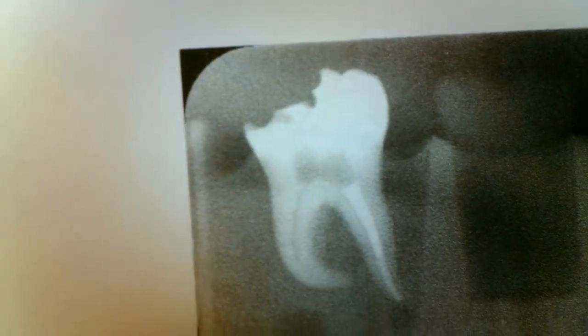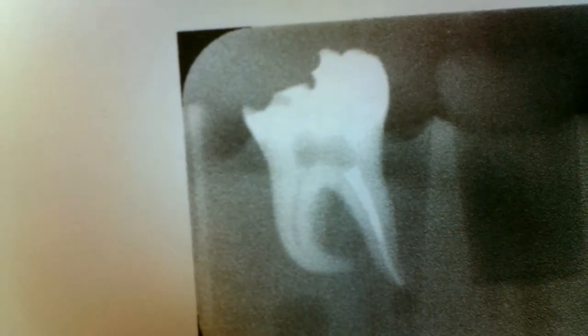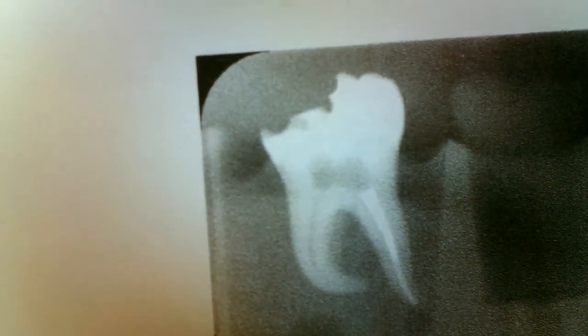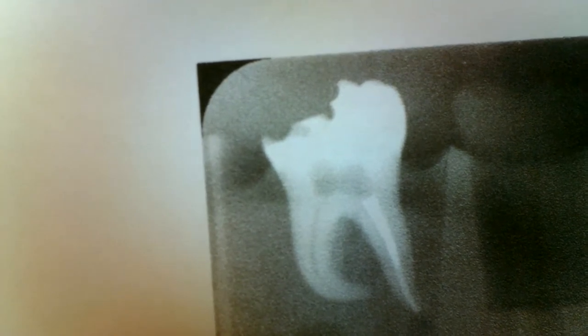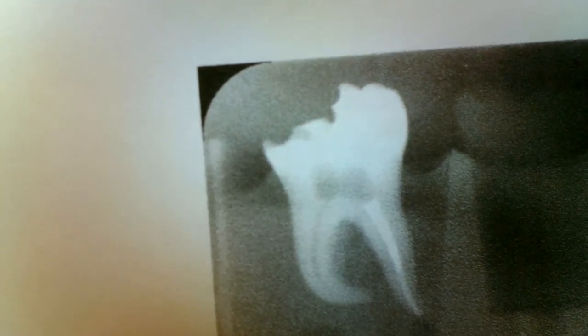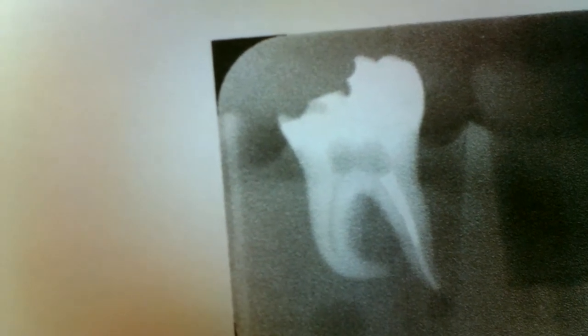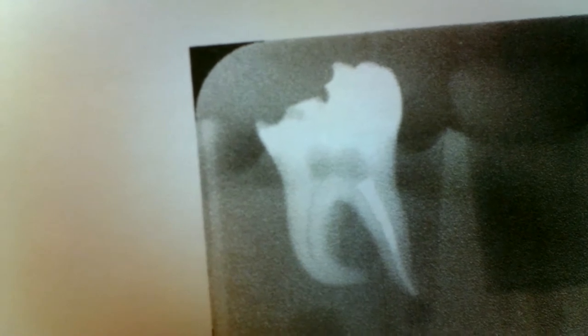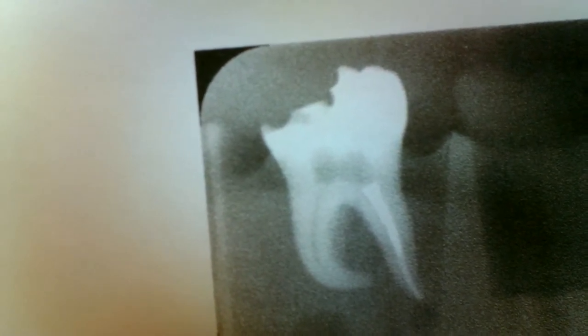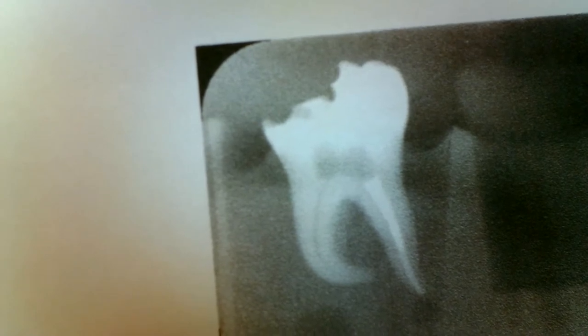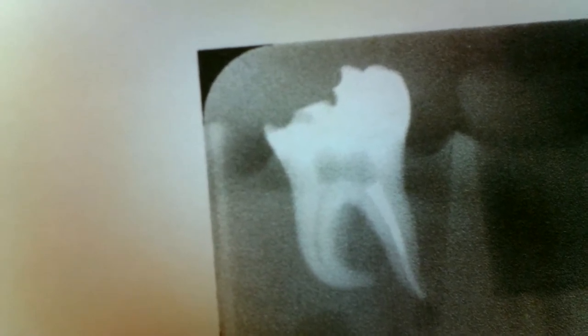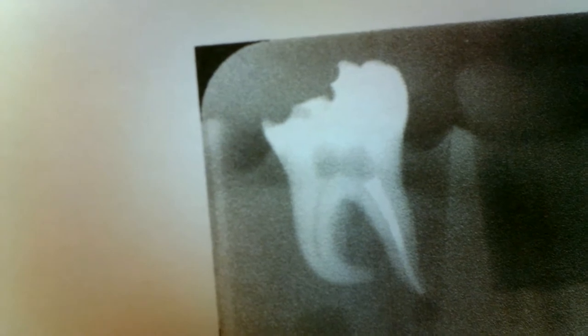Here's a picture of the tooth broken down, and we just did a root canal in the distal root. We took a measurement and it's 19 millimeters from the marginal ridge to the end of the root. We want to have at least 5 millimeters of gutta percha left, so that means we could technically put a 14-millimeter post in, but we're probably only going to go about 10 millimeters down the canal.